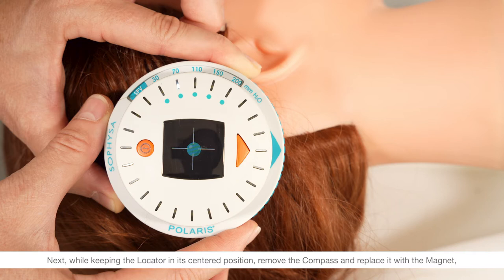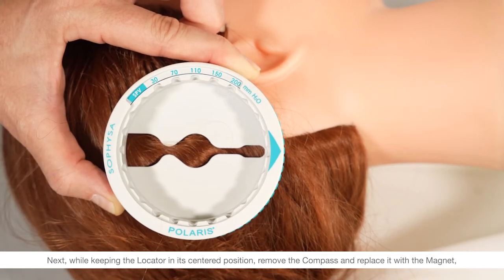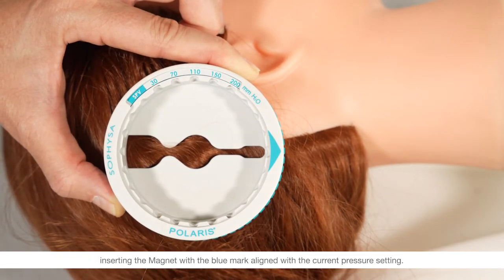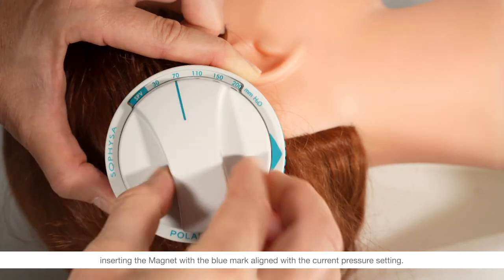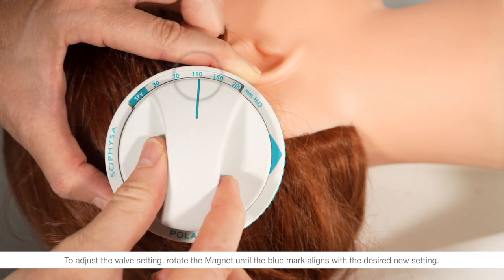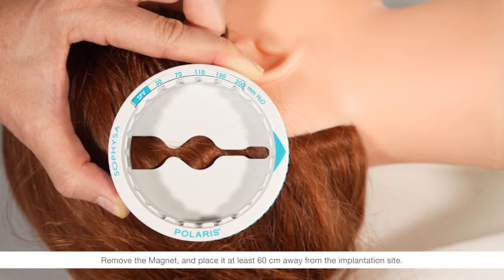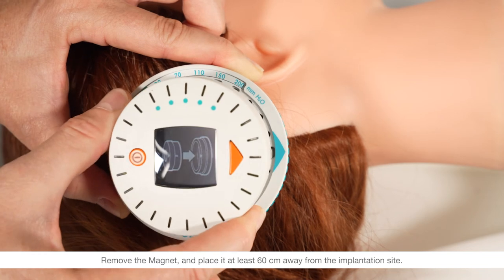Next, while keeping the locator in its centered position, remove the compass and replace it with the magnet, inserting the magnet with the blue mark aligned with the current pressure setting. To adjust the valve setting, rotate the magnet until the blue mark aligns with the desired new setting. Remove the magnet and place it at least 60 centimeters away from the implantation site.